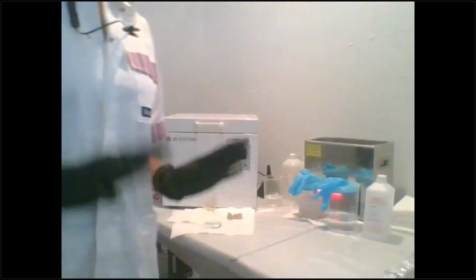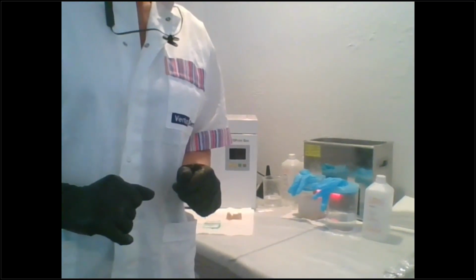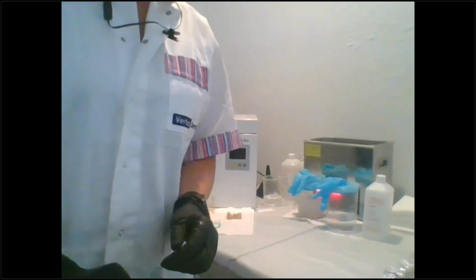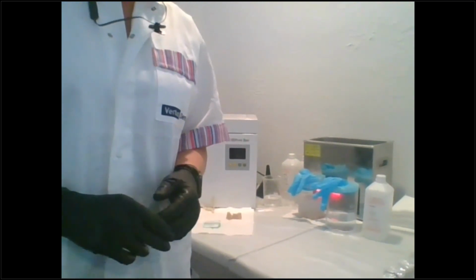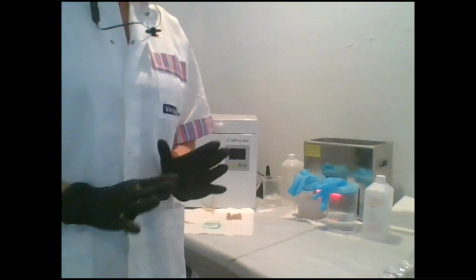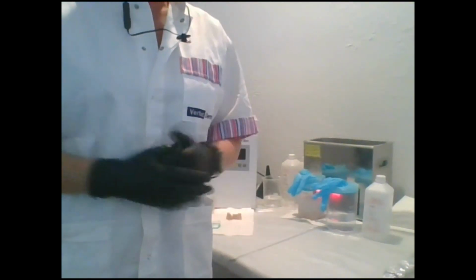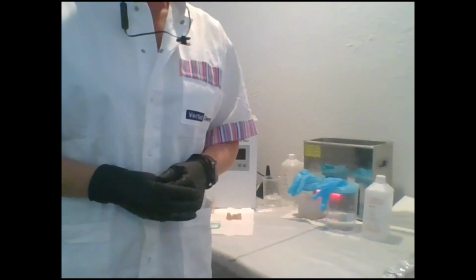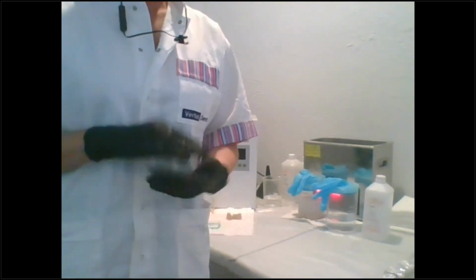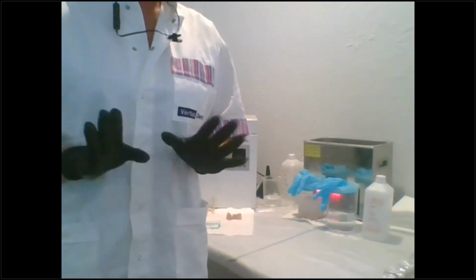So with that, are there any questions about my post-processing station? Yes, somebody is wondering, how would you advise to dilute 99% IPA to 91%? Yeah, so just use it. Look, it can be slightly arbitrary, okay? Just put about 1/10 water, basically. I just added water in mine when I couldn't get 91. If you don't use 91, or if you don't dilute it, you will get white residue on all of your stuff. So you want to make sure you do dilute that. Water should work fine.